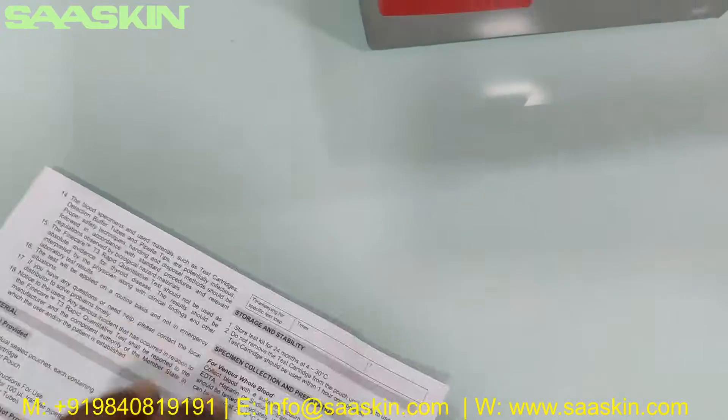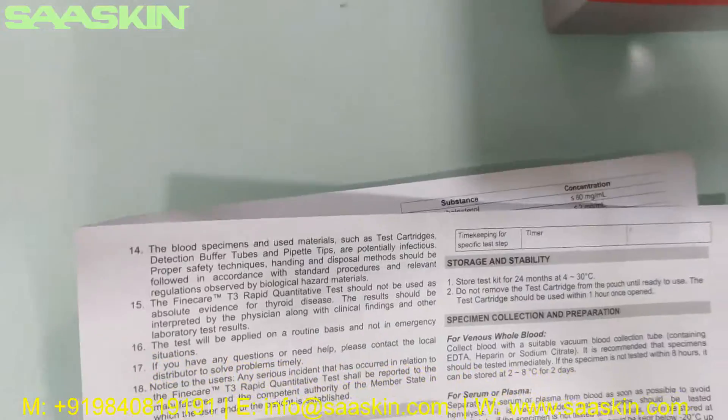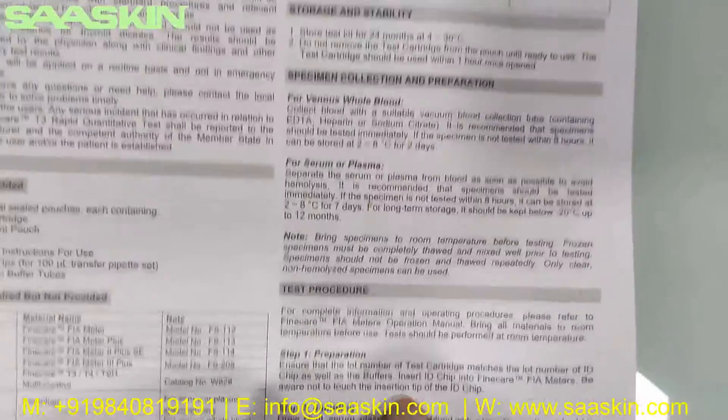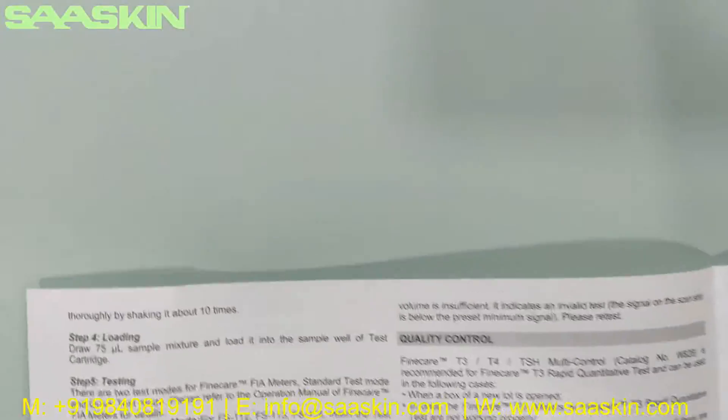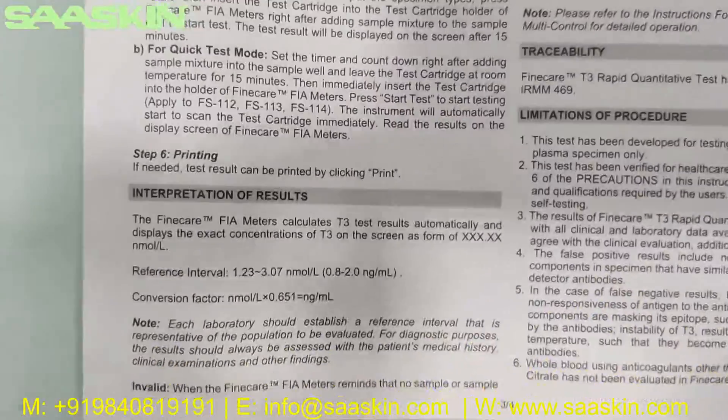This is the IFU brochure, or instructions for use, which has the complete details — including test procedures, storage, how to collect specimens, limitations of the test, and how to interpret your results. So you have the complete details to conduct the test.